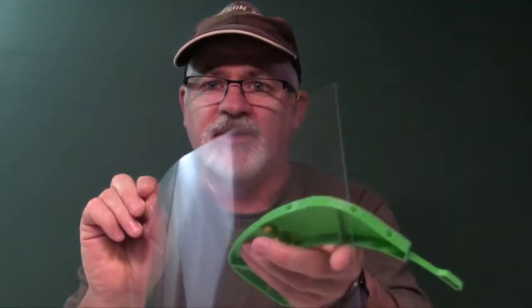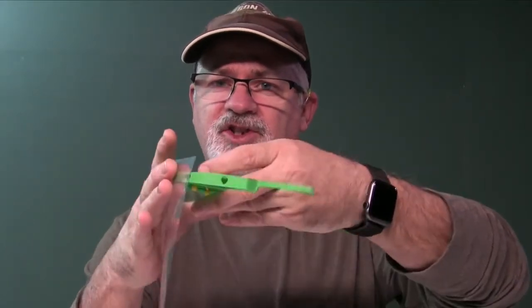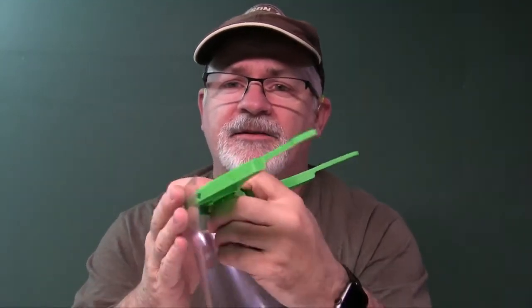Now that we've finished constructing the actual shield here, the frame, this is a plastic sheet. This is 10 mil plastic sheeting, pretty heavy duty stuff. And we're going to talk about how we attach this to the front of the actual frame, and how we then attach the ribbons that we're going to be using to attach this around somebody's head. So look at the parts that we need and the procedure that we use to put this all together.